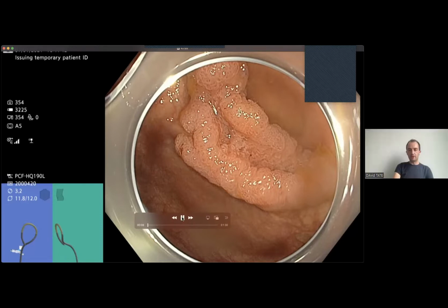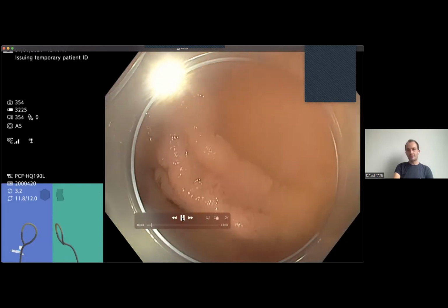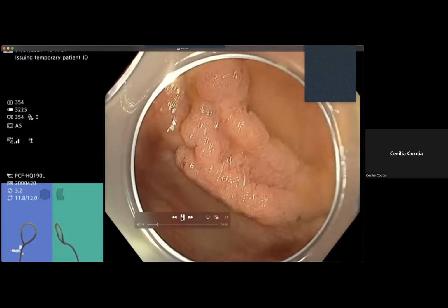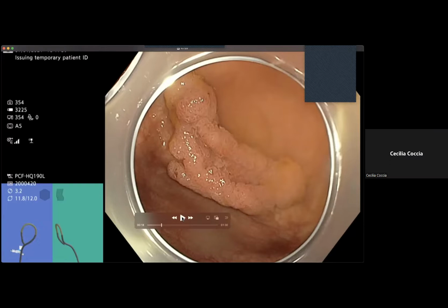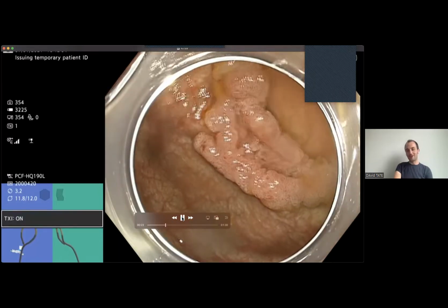So I'm going to play the video, obviously. Your blink impression, your first impression, just looking at that polyp, is that cancer? I'm concerned about the depression in the center, which may make it cancerous. Okay, perfect. So let's have a closer look at that, because that's very important. If you had to come down on one side of the fence before we go further, cancer or not cancer? Initially not cancer, so I'm going to stick to that. Okay, stick to that, because you would be right. And it's very interesting how that goes.